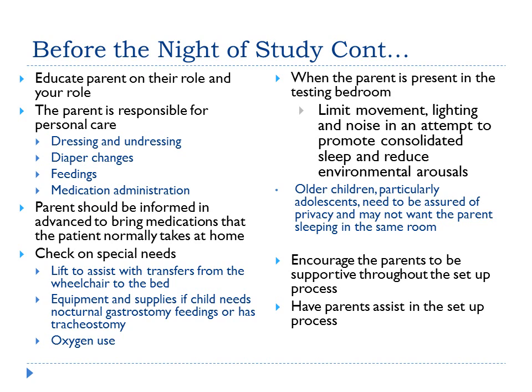Some other factors you want to consider before the night of study is educate the parent on their role and your role. The parent's going to be responsible for all the personal care for the child. This means dressing and undressing, diaper changes, feedings, and any medication administration. The parent should be informed in advance to bring all medications that the patient normally takes at home. Then check on any special needs. Do you need a lift to transfer from the wheelchair to the bed? Do they need oxygen? Do they need suction equipment?